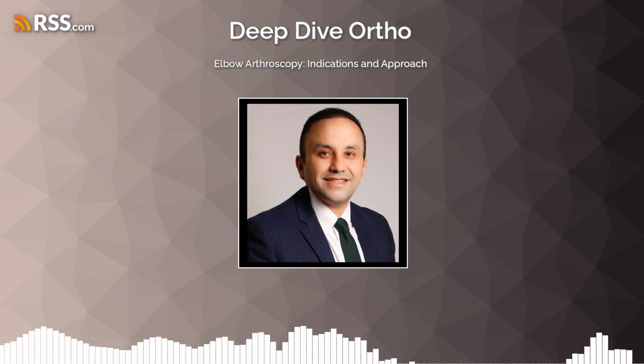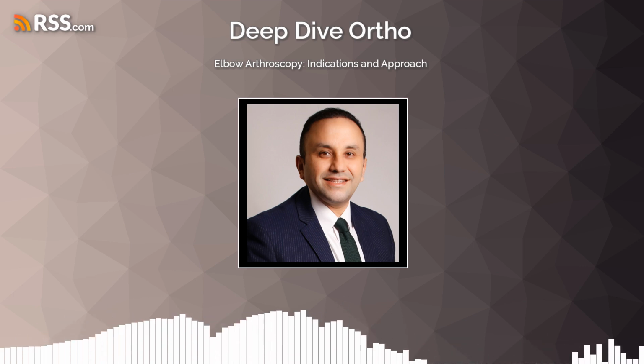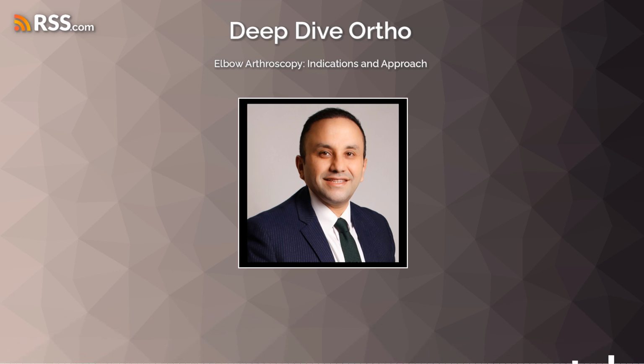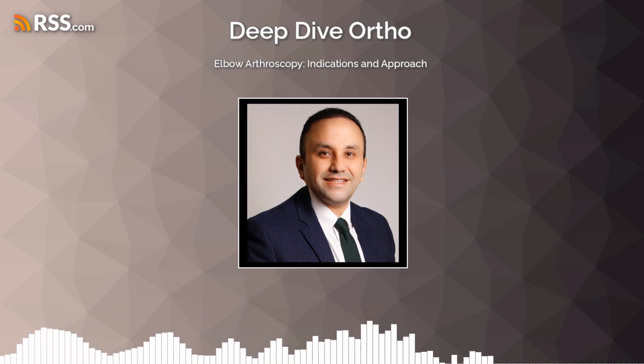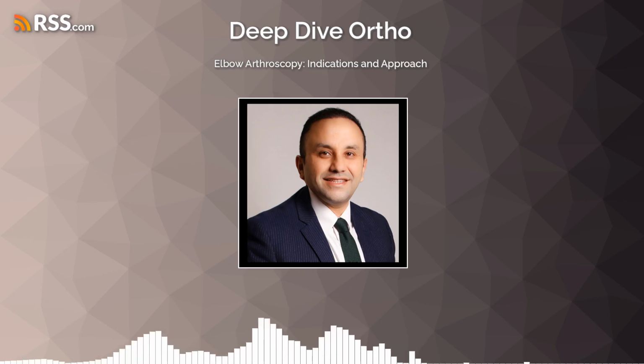For chronic attenuation, arthroscopic plication is typically performed. This involves placing 4 to 7 absorbable sutures obliquely through the LCL complex, starting distally and moving proximally. The suture ends are passed underneath the LCL complex origin on the humerus and then sequentially tied outside the capsule to tension the ligament. Tightening up the stretched ligament.